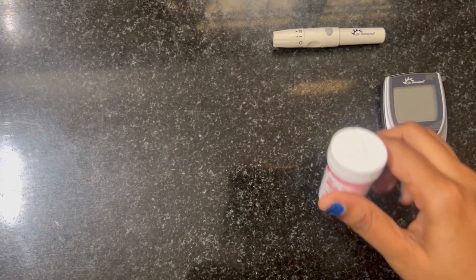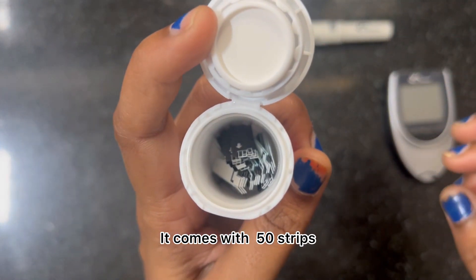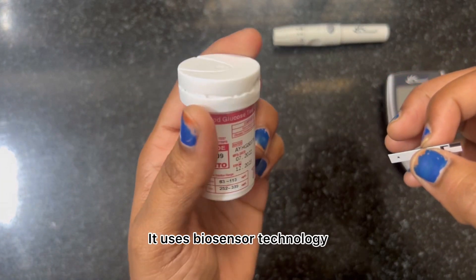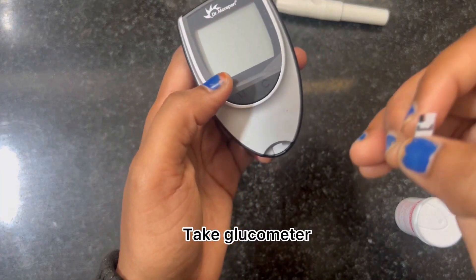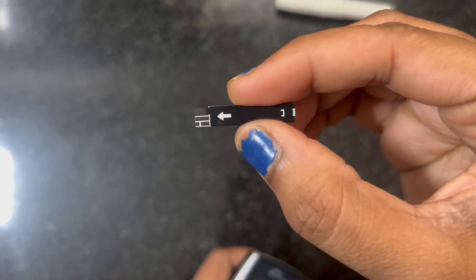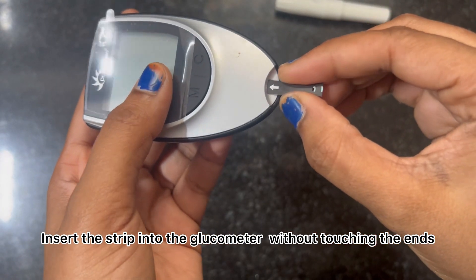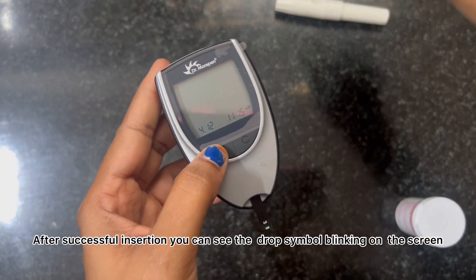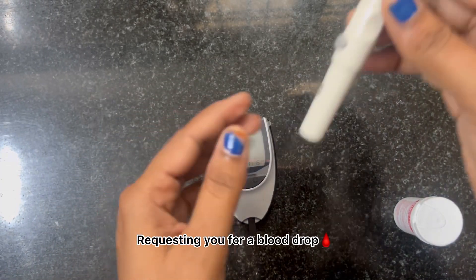I'm comfortable with number 2. The kit comes with 50 strips — take one and make sure you do not touch the end of the strip, as it uses biosensor technology. Take the glucometer, follow the arrow mark, and insert the strip into the glucometer without touching the ends. After successful insertion, you will see a drop symbol blinking on the screen, requesting a blood drop.